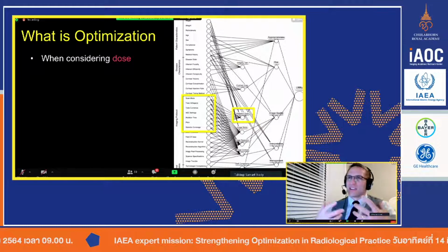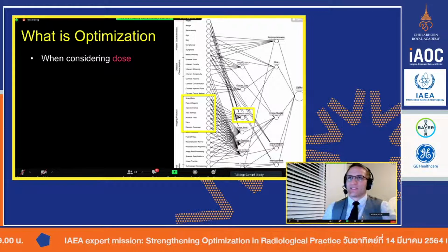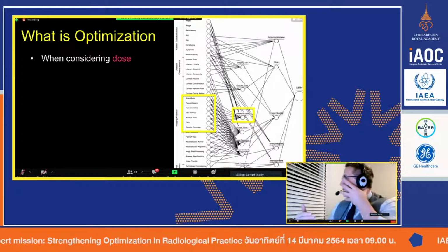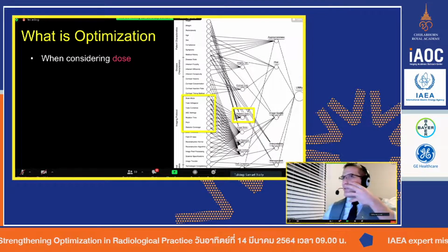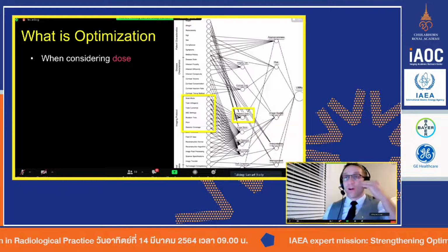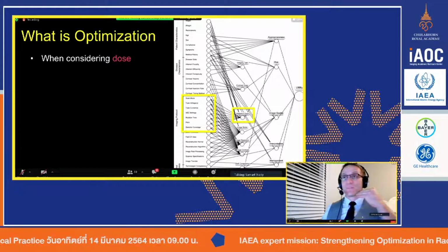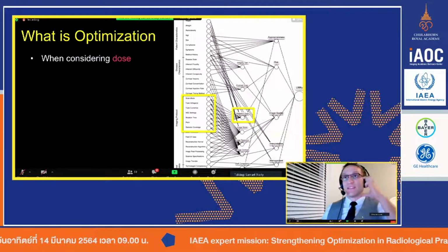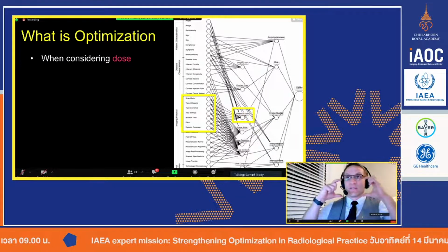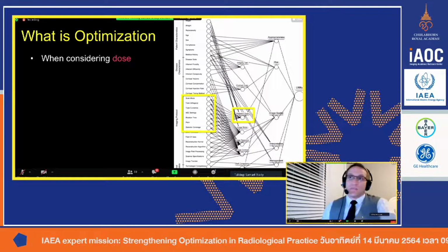And so it doesn't actually usually require as much radiation. Typically, when we're doing face, just because when you look at the profile of the face, your face profile changes a lot more than your skull. And so using tube current modulation is great. But if you can, doing a single spin across your face, if you have the 160 millimeter scanner, that's appropriate too.